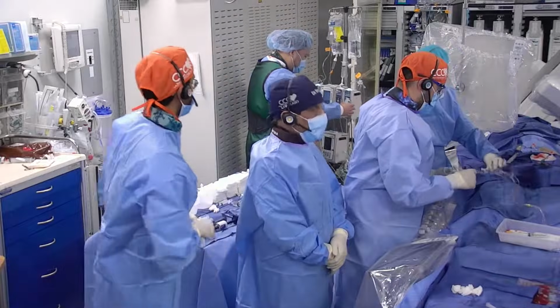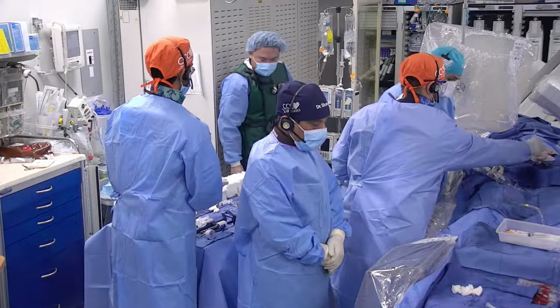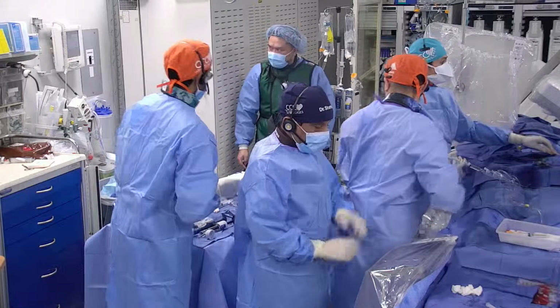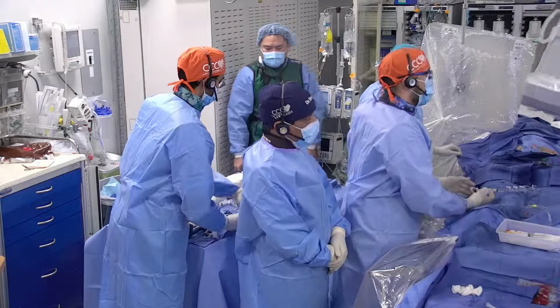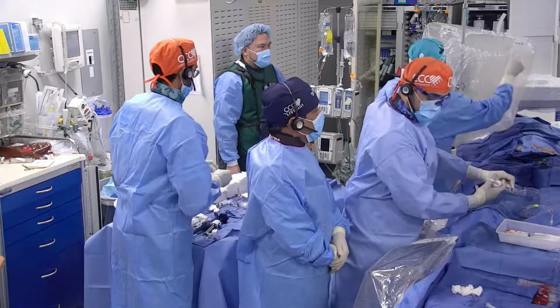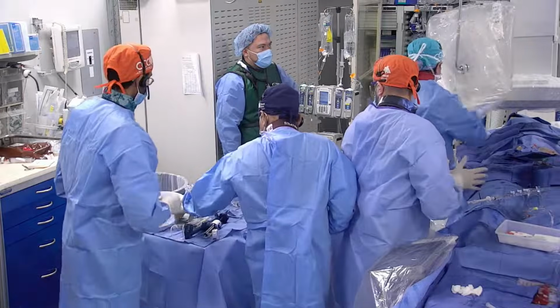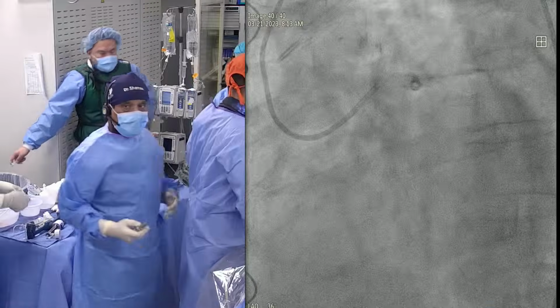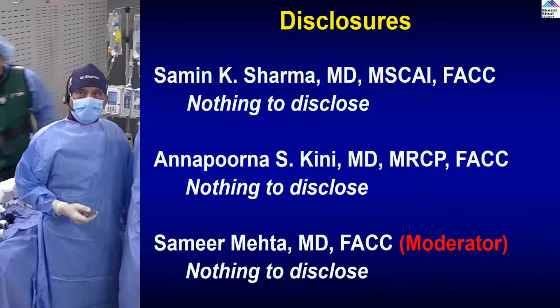Patient had an angiogram a few weeks ago, which Anu will show, and this area has a very underexpanded stent, and of course there is a restenosis. So those two things will be shown here. So Anu, let me start with the angiogram first, the presentation, before we start the slides.